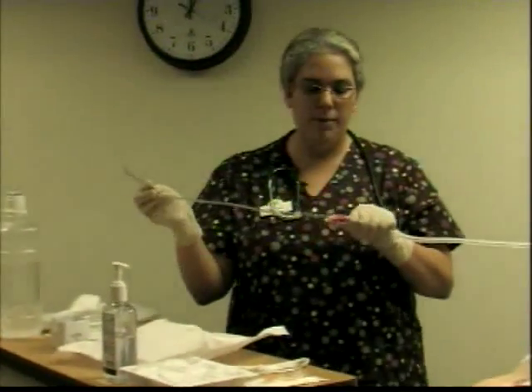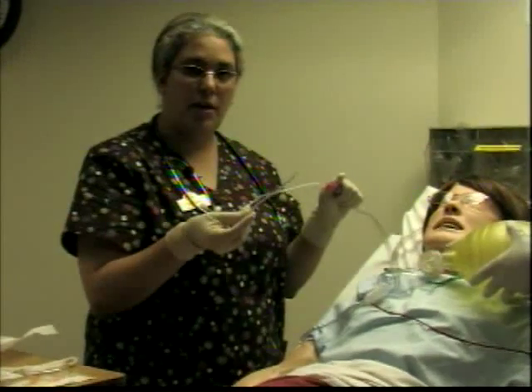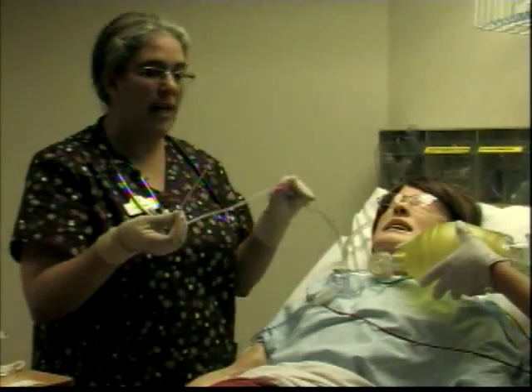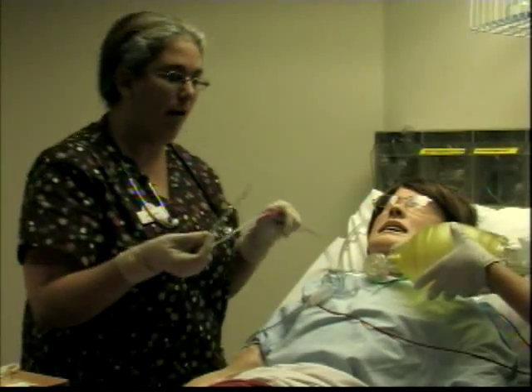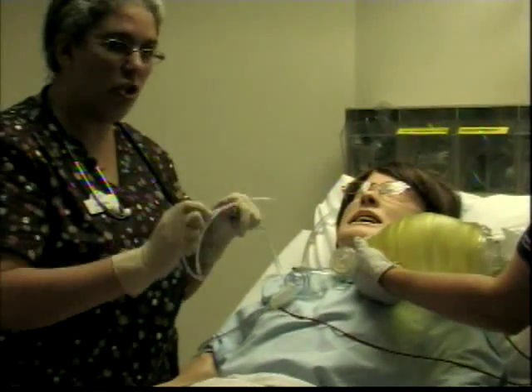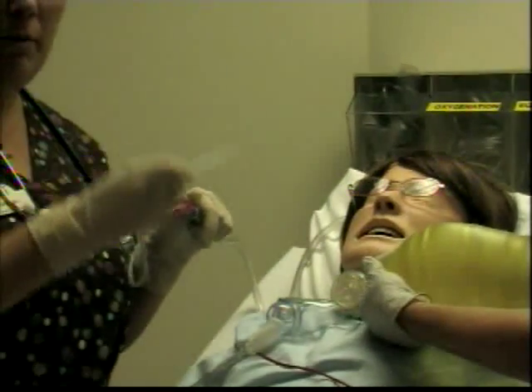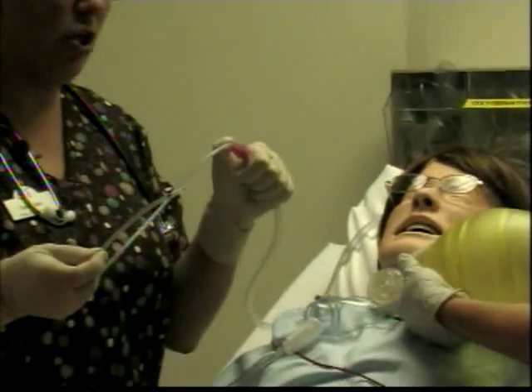Okay, there we go. So now my assistant is hyperoxygenating my client. I'm looking at the vitals. Everything seems to be well. I'm looking at the color and the respirations of the client. And I'm going to tell them, now I'm going to go in. You want to make sure that the tip of the catheter doesn't touch anything around. And I will tell my assistant every time she needs to remove it and replace it. My thumb is up. It's not putting pressure. It's not putting suction in it.